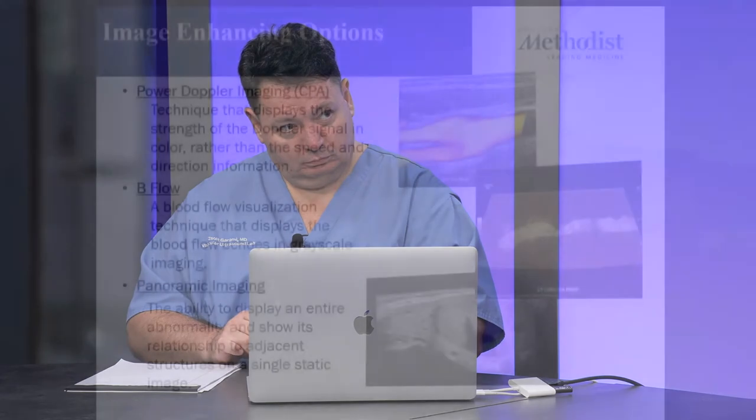So it's a very interesting comparison between imaging modalities. With CT and MRI, you're lying down and you don't have any movement. This is at least a non-physiological position for any testing, because you move your neck, and this is where ultrasound is definitely the more physiological position. Yeah. This is why I think that tiny sentence Stephen said, we slightly turn the head, was really interesting. Just changing the position gives us different hemodynamics in the flow. True. I just feel if we have multiple tools in our toolbox, why not use all of them sometimes?